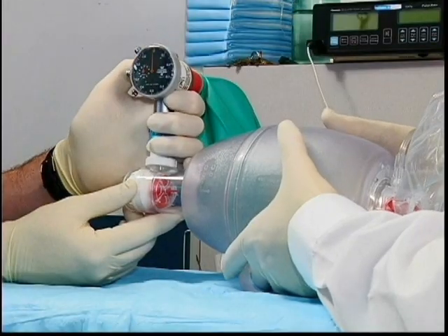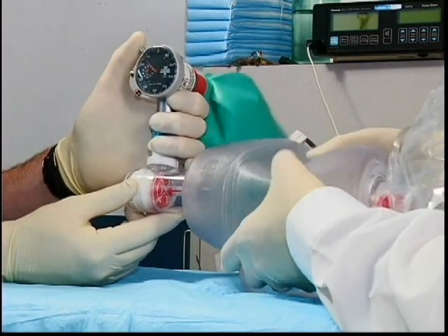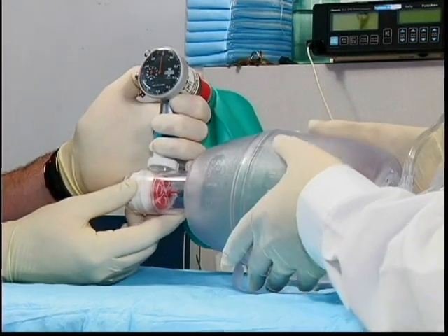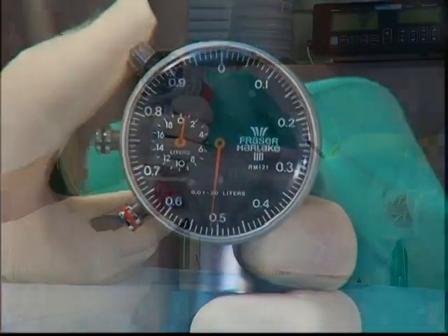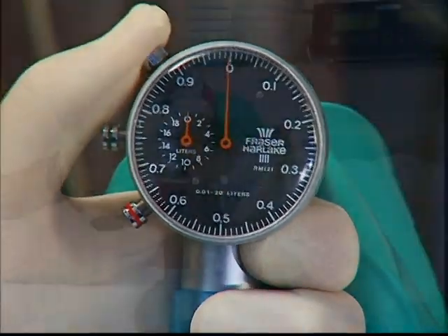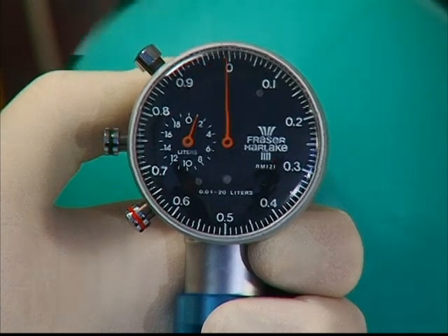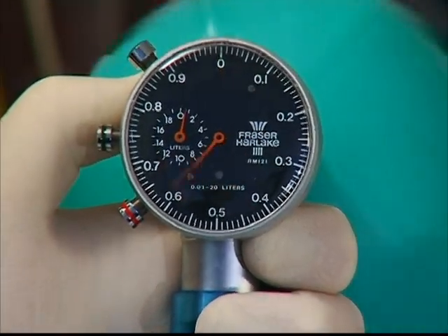The size of the breath, referred to as tidal volume, that you deliver to the patient is determined by how hard you squeeze the bag and whether you use one hand or two hands. Squeeze the bag with one hand and observe the volume delivered. As demonstrated here, 500 cc or 0.5 liter were delivered with a one-hand squeeze of the bag. Now squeeze the bag with two hands — 1,000 cc or 1 liter of air were delivered with two hands squeezing the bag.